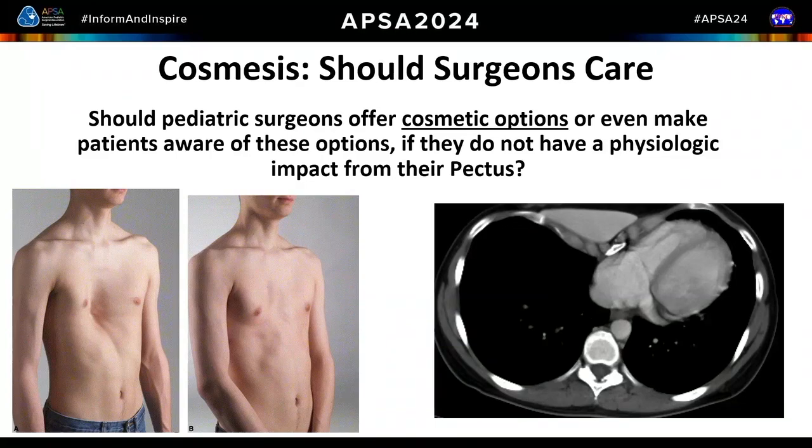All the kids that have failed vacuum bell therapy, failed in quotes, that went to the operation, they had the easiest postoperative course because I think they're flexing their chest. There's no way to ever prove that, and I'm honest with that. But I think just like all exercises, the kids who exercise, they're home post-op day 1 and 2 with much better pain control because I think of that flexion. So it's another benefit that there's zero way ever to prove what I just said. But the vacuum bell works. It's low percentage.